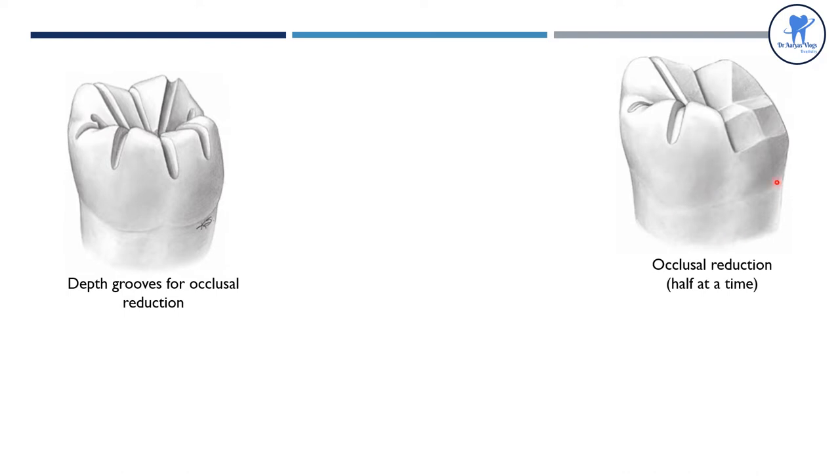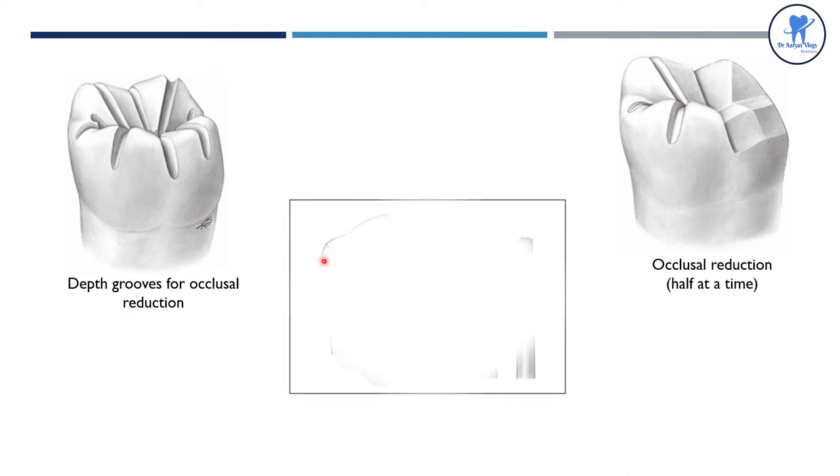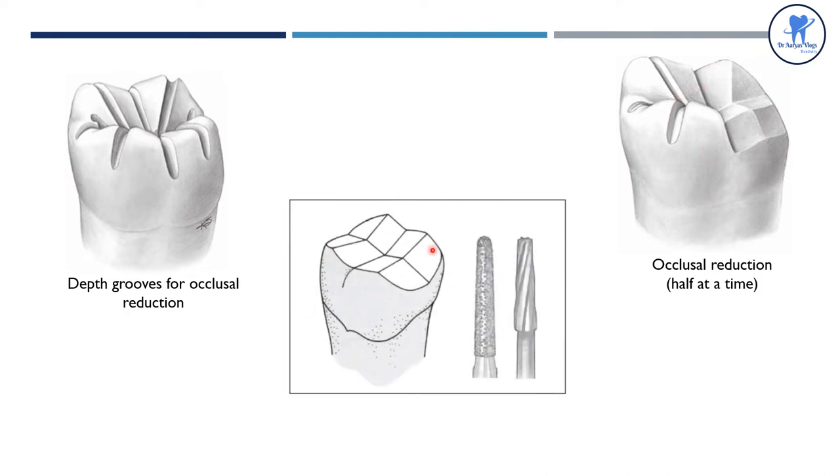The occlusal reduction is performed half at a time, so half of the occlusal reduction is completed and the other half is maintained for reference purposes. The occlusal reduction is done using a coarse grit round and tapered diamond, number 171L.